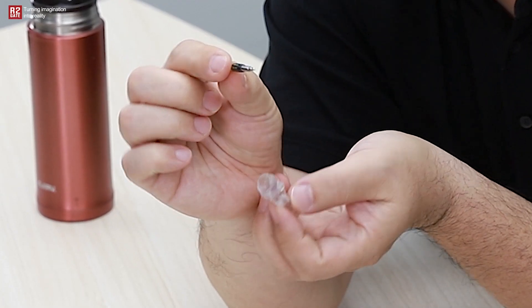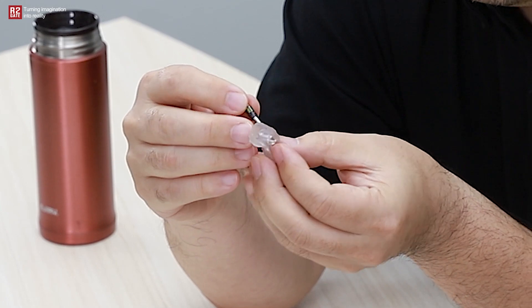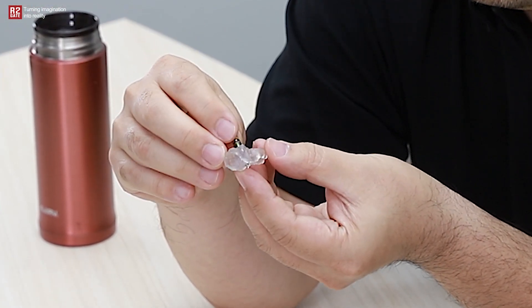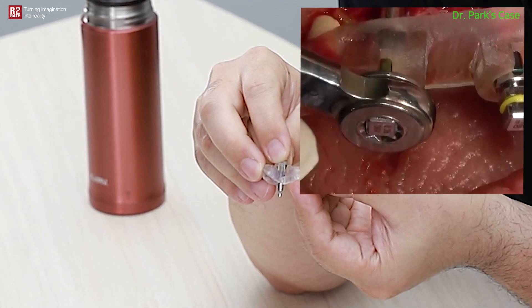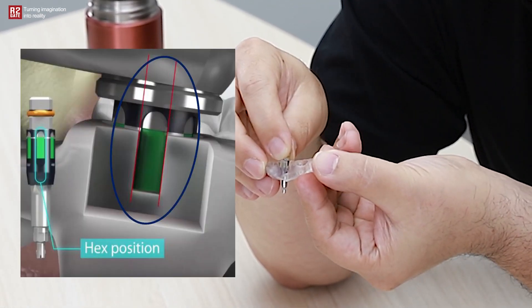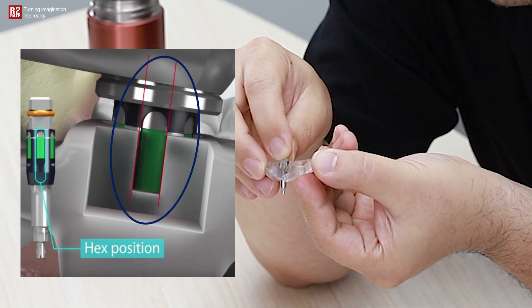This is one of our R2 guide's main benefits. Here is the implant carrier — can you see the green color? That's the hex position. There's a window, so when you can see the green color through the window it means the hex direction matches exactly as planned. This is very important — our guide system can match the internal hex direction, which is critical for same-day temporary or final crown delivery.